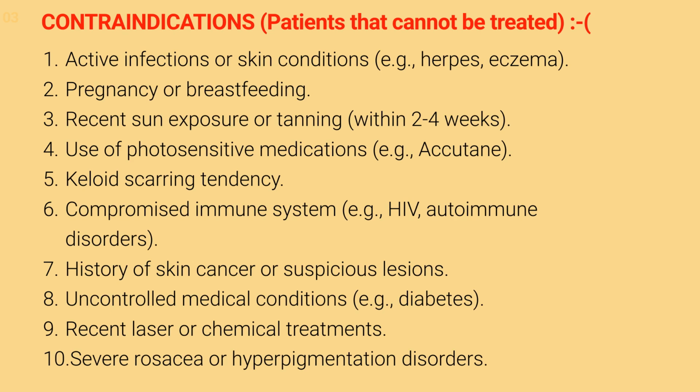Severe rosacea or hyperpigmentation issues. Conditions that cause hypersensitivity in the skin, like severe rosacea or melasma, can be exacerbated by laser treatment. Careful patient assessment and consultation are essential to avoid complications and ensure the safety of the procedure.